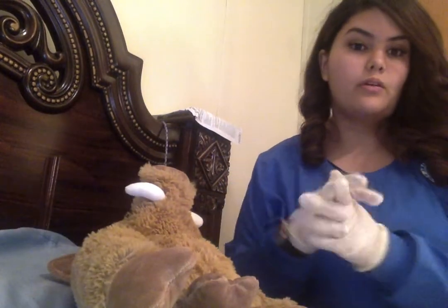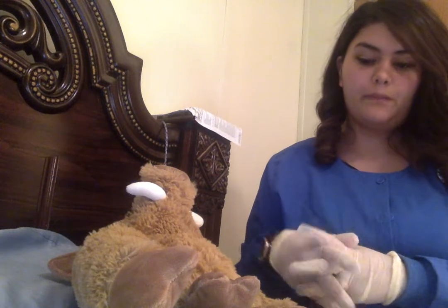railing for that, but not the side rails. We never put a catheter on the side rails because the patient could pull up or down the side rail and it could really mess up our catheter.